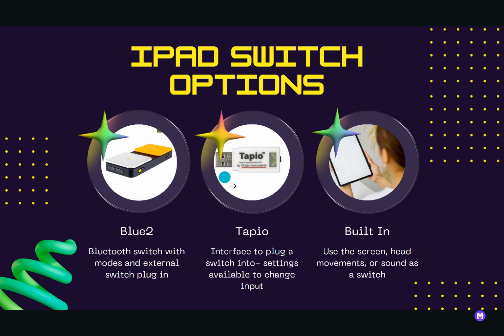Then we have this real simple Tapio switch interface, and this will connect directly into your iPad using a Lightning to USB adapter. And then you can directly plug your switch into the Tapio interface.